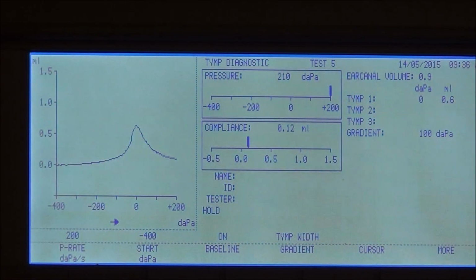So this is what I told as pressure effect, right? So as the direction of sweep changes, you will find the peak pressure changing. Suppose it is because of some pathology, which is crossing borderline values between C type and A type, things like that. Then you've got to check whether it is really sweep effect, pressure direction effect, or it's because of pathology.